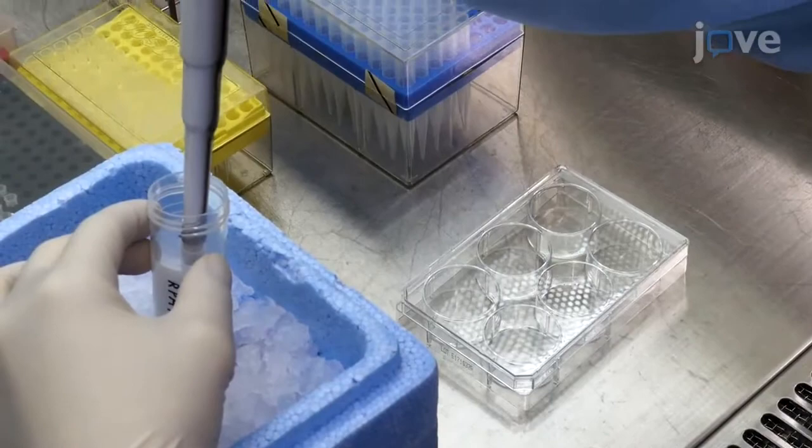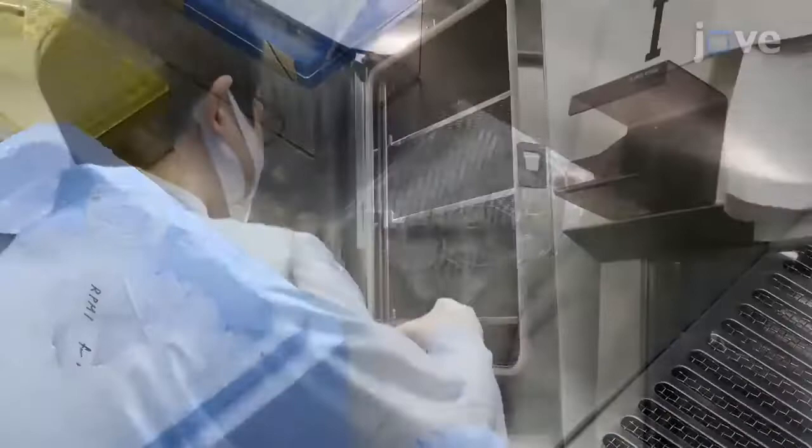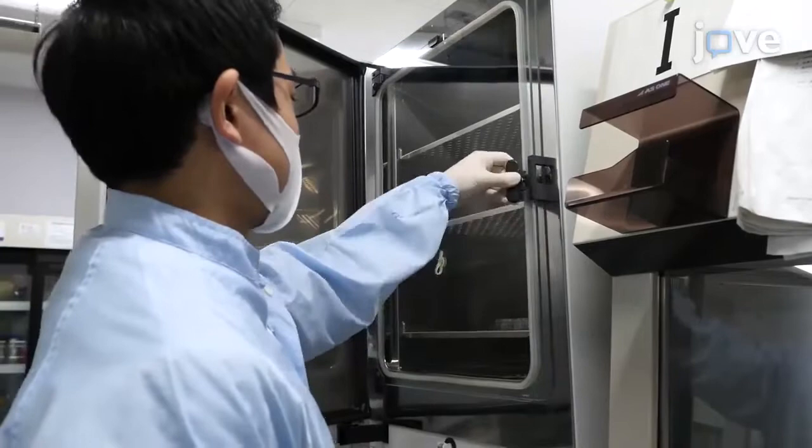Next, use a pipette to transfer 2 mL of the diluted basement membrane matrix into each well of a 6-well cell culture plate. Incubate the plate at 37 degrees Celsius for 60 to 90 minutes. After this, keep the plate at room temperature for up to 3 hours until ready to use.